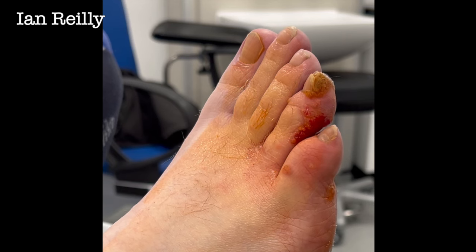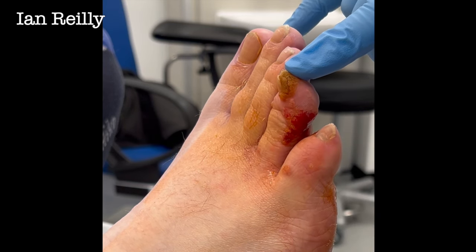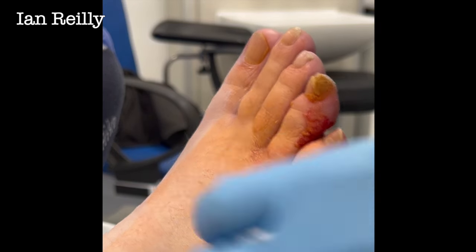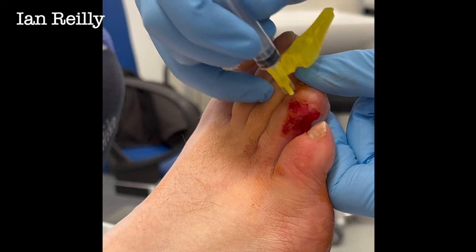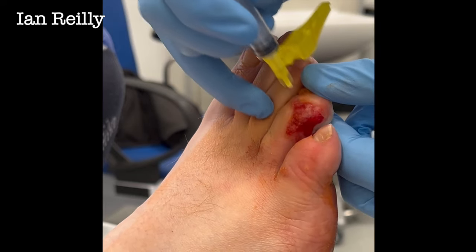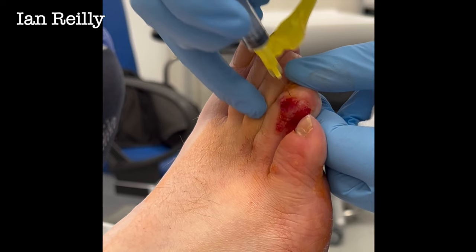Like a good clinician, I put the used syringe straight in the sharps bin. Can I get another syringe please? — because it's the one I used for the local anaesthetic. That's the overlying callus — you can actually see it. I'm going to use this little tiddly one, just because it's nice and handy. Kevin, if you feel any sharpness let us know. Basically what we do is repeated thrusts in a darting fashion — that's what the paperwork says. I know it sounds a little bit salacious. We're trying to pop as many verruca cells as possible.